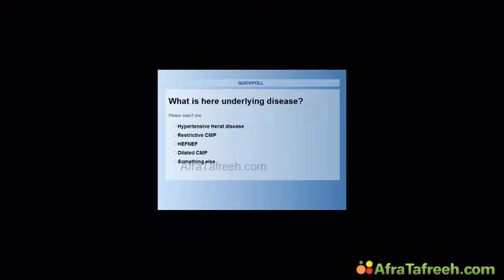Yeah, you know, usually when we ask these questions, most of the people opt for the something else because you don't really want to give away the diagnosis in such multiple choice questions. So I can see that many people are already choosing something else. Okay, 63% of you have voted. I'll give you another second.